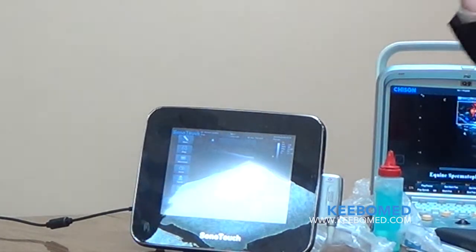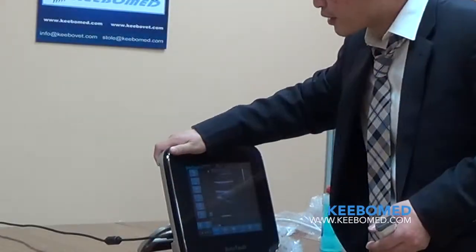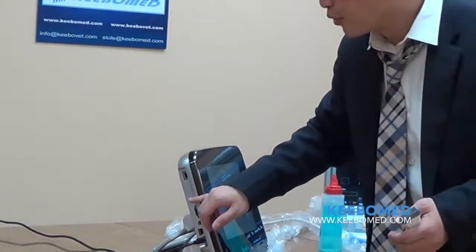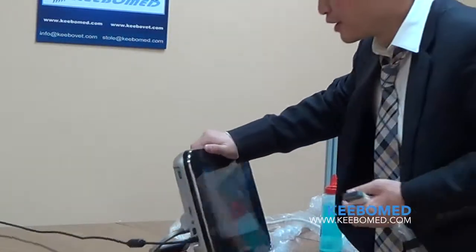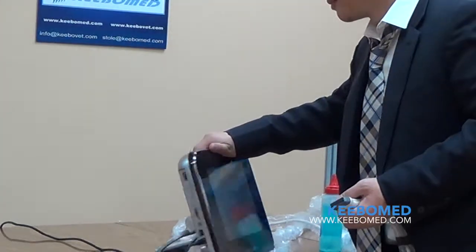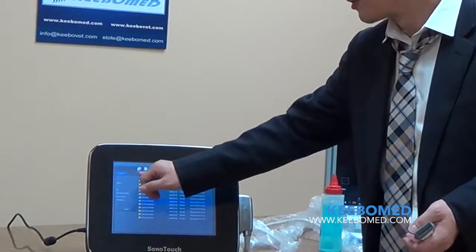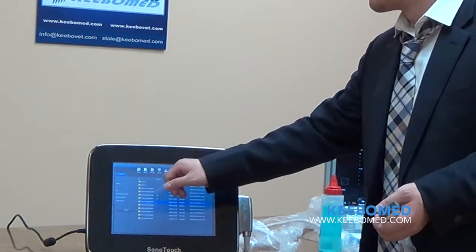So this is our SonoTouch. As I said, it's very intuitive. For connectivity, sometimes doctors want to transfer images — maybe they want to print them, or send them to a PACS system. On the left side of the system, we have three USB ports, a VGA port that allows you to connect a bigger monitor, and a video port to connect a video printer. There is only one physical button on this system — the power switch — which we have hidden on the side to keep the front interface fully waterproof. You can view the history of all patients, choose a case, record it, copy it to a USB drive, or send it to PACS via DICOM.